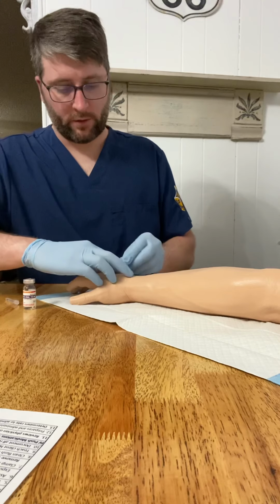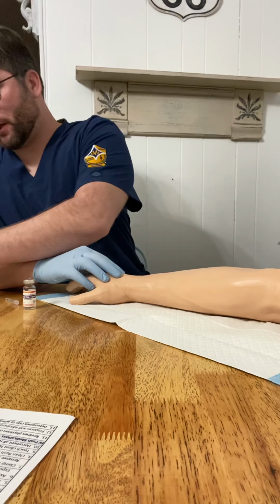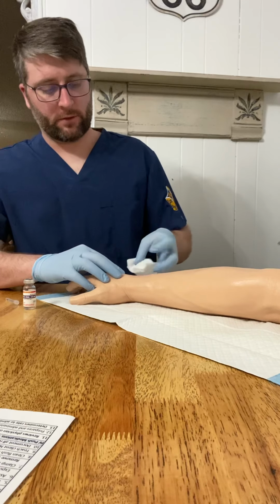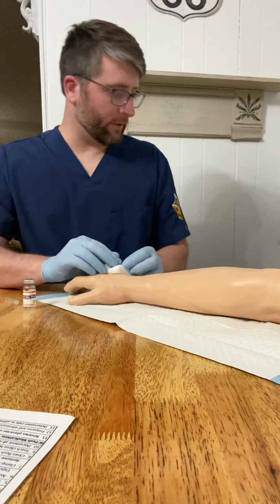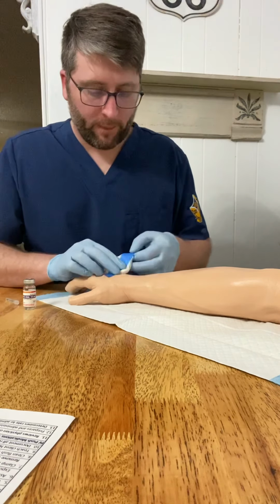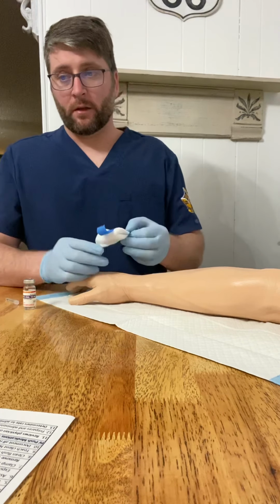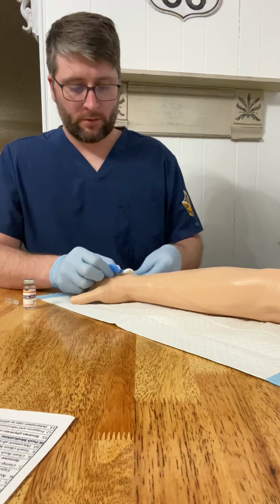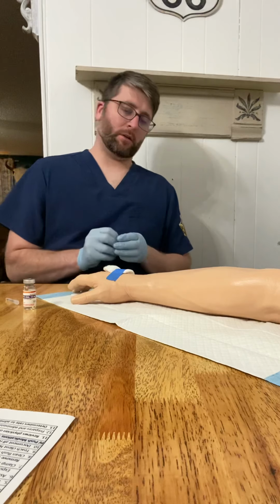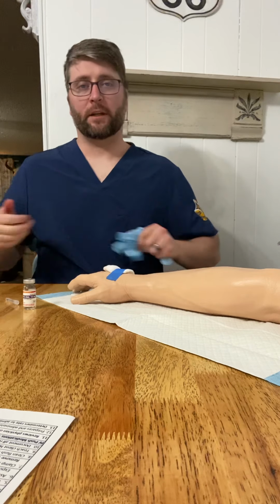And then we are going to, with one quick motion, withdraw the catheter from the site. And then we got some gauze pad here, put that over. We're going to observe to see if there's any redness or anything going on at that site. Use sterile gauze, cover the site with sterile dressing. Discard our equipment as necessary and document all pertinent data. All right, thank you.